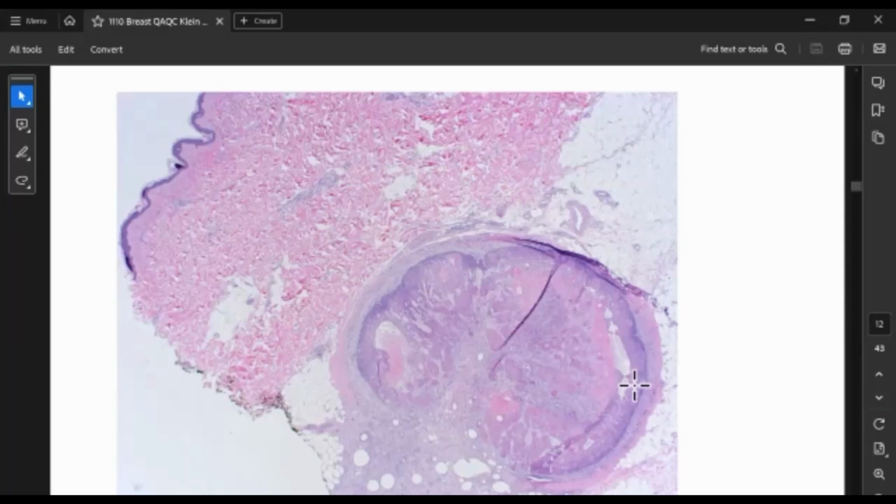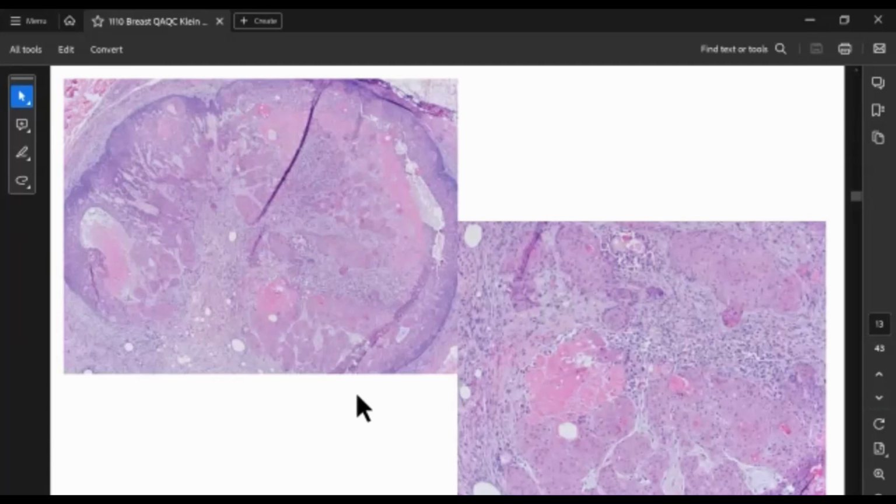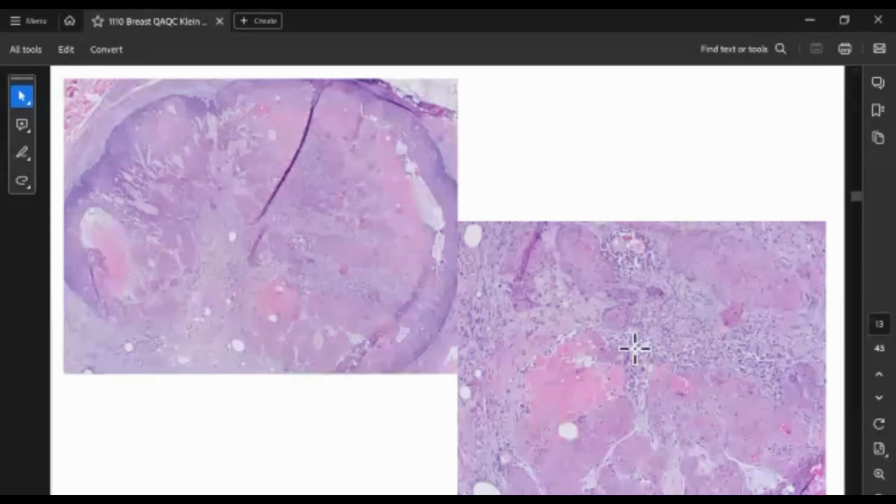And here's the lesion. And you can see we kind of got a hint of this in some of the cores where it has this nicely circumscribed border. It's now been distorted a bit because it's had a needle stuck through the middle of it a few times. So you have biopsy site changes as well. But when you look at it more closely, you can see like, okay, if you stuck a needle through this thing, it's gonna look like this. And it looks like an invasive squamous cell carcinoma.